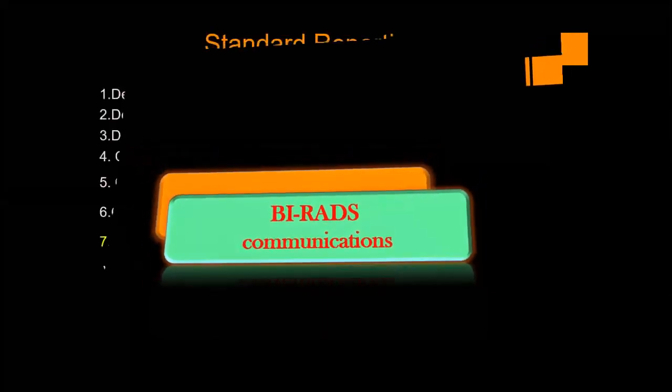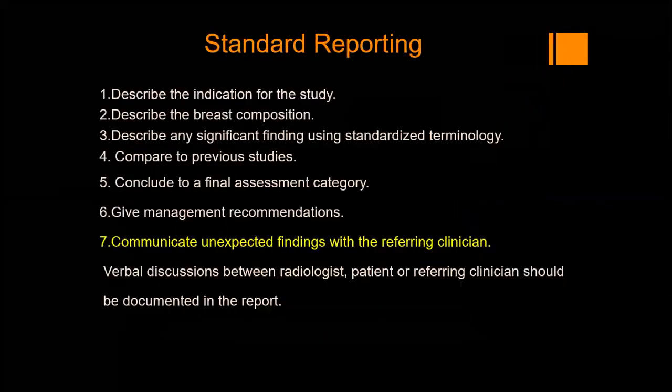BI-RADS communications. We said in the mammography report, the last item is to communicate with the referring physicians. Communicate unexpected findings with the referring physicians.